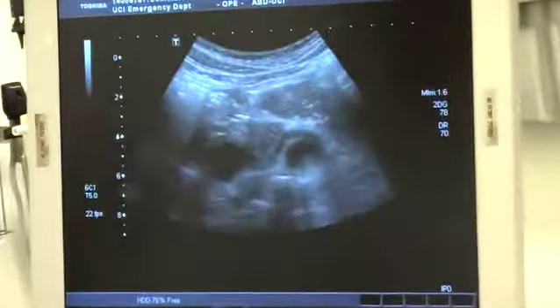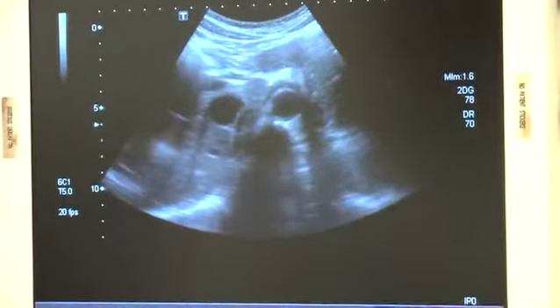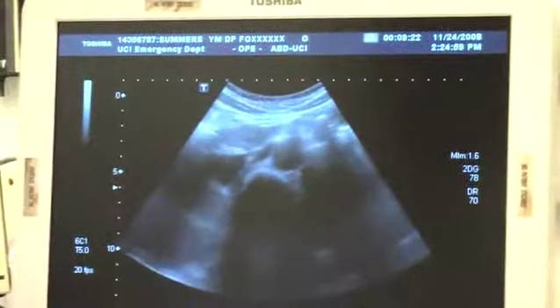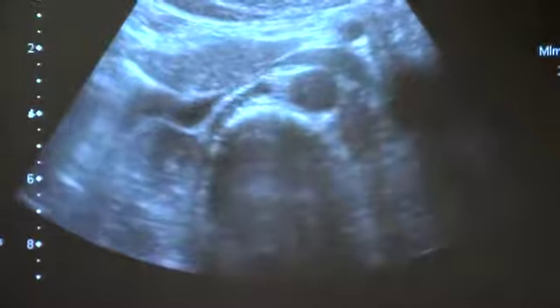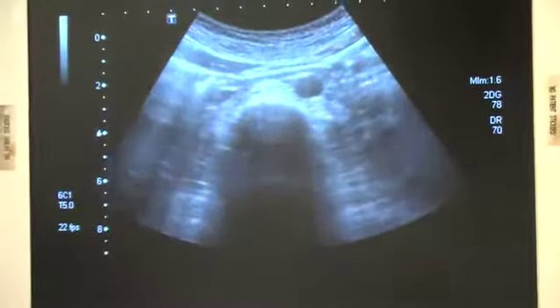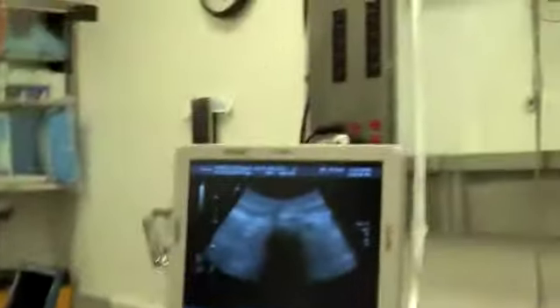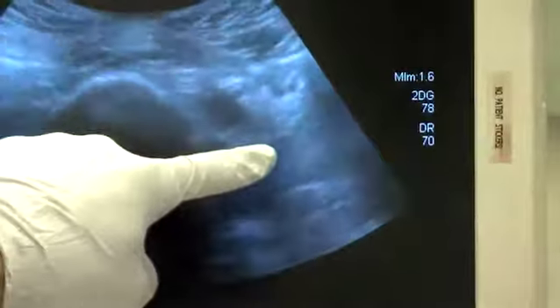So we're going to drop our depth down just a little bit, because as we slide down, keeping the spine shadow and the aorta and IVC in view, we can notice our next takeoff is the SMA, which is coming onto the screen here. And we slide down. We're going to decrease our depth now as the lordotic curve is going to push up the vertebral column. And we're going to maximize our image coming all the way down to about the umbilicus, and then the bifurcation of the aorta. At the bifurcation of the aorta, we're going to follow each iliac down, as each iliac could independently have an aneurysm.